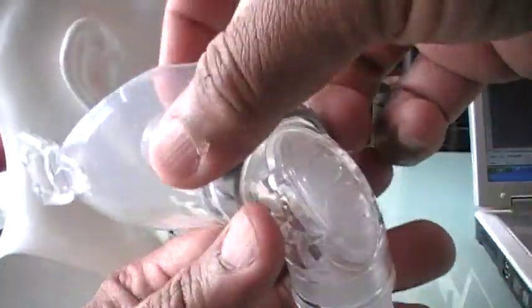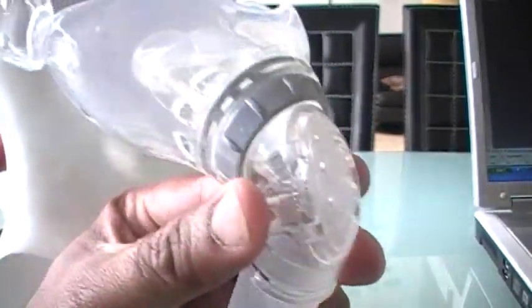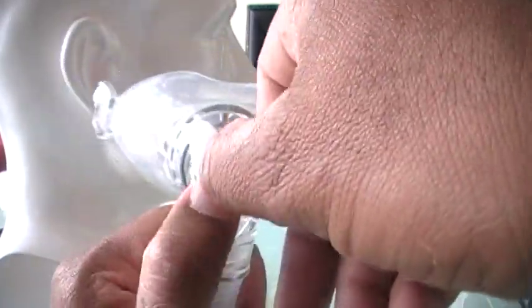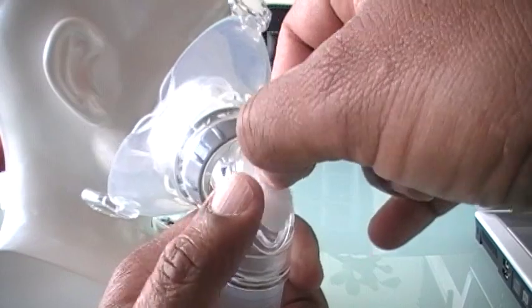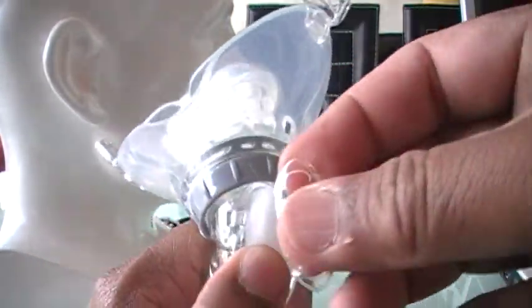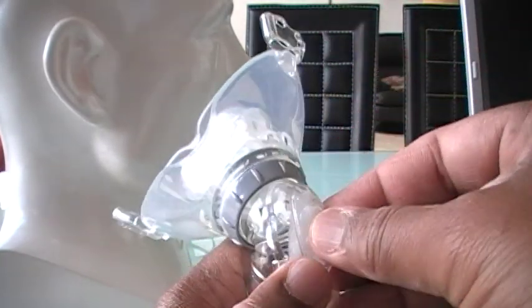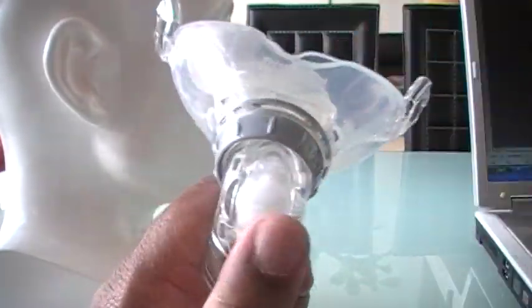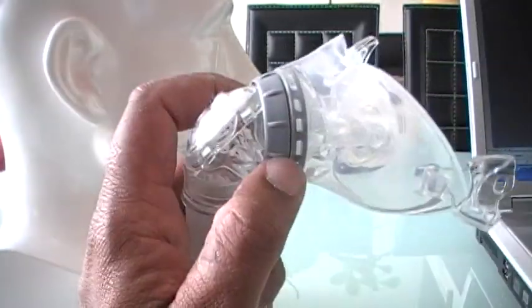This here is your exhalation port. It is also an irritating thing — it's one extra thing you have to work with. It has a filter in here that helps disperse the air so it doesn't hit your bed partner so directly. But then you've got one more thing to maintain. You get extra filters with this, but you would have to order extras when these run out. You cannot wash them.